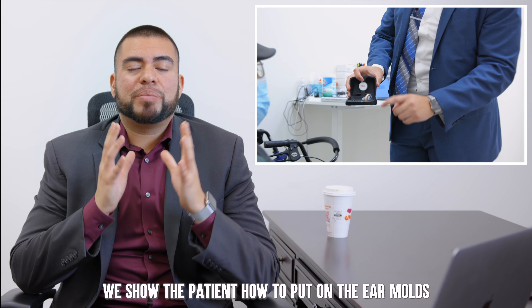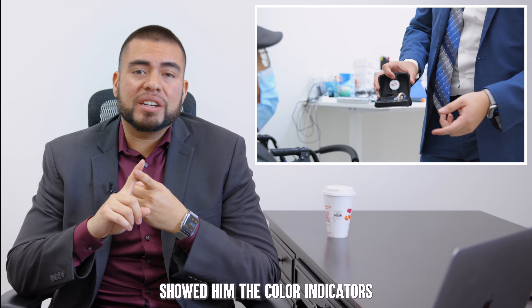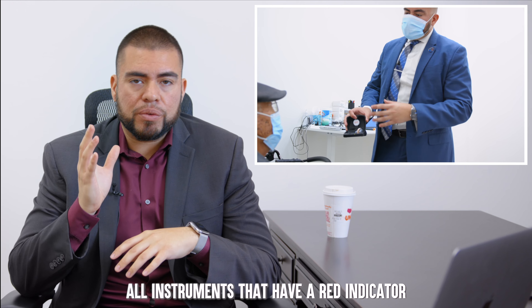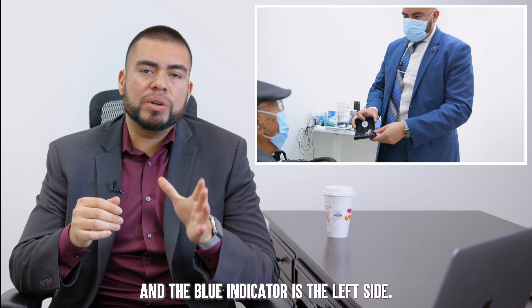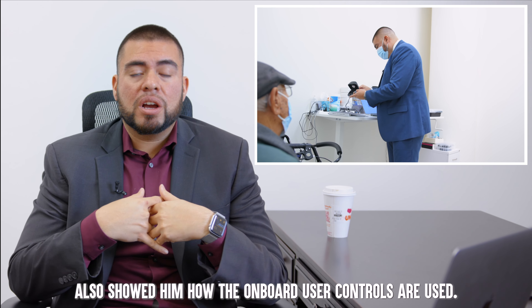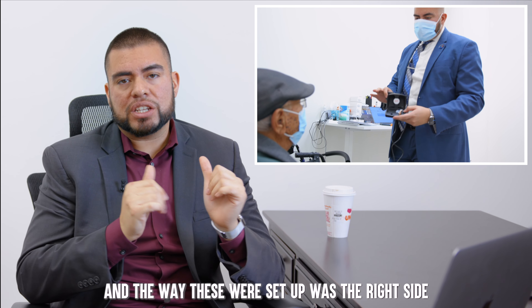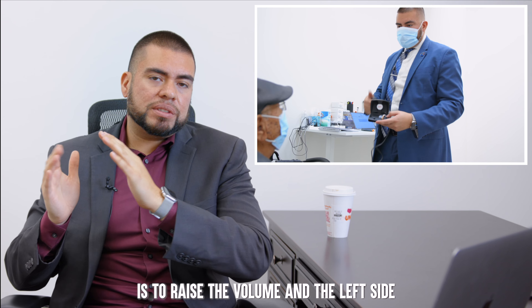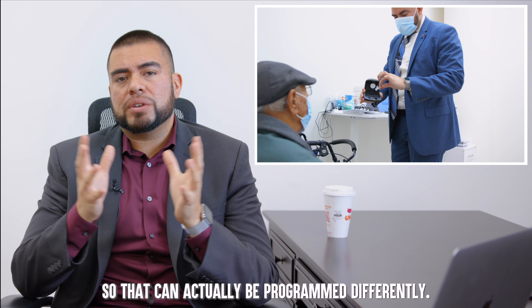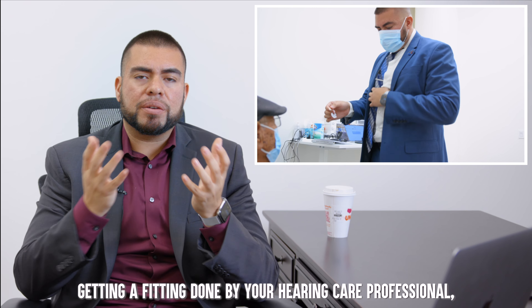We showed the patient how to put on the ear molds and the hearing aids correctly. We also showed him the color indicators — each side has a color: instruments with a red indicator are always the right side and the blue indicator is the left side. We also showed him how the onboard user controls work. These have one button on each side — the right side raises the volume and the left side lowers the volume, and they go up and down together. That can be programmed differently, so always make sure you understand how your controls are set up when getting a fitting done by your hearing care professional.